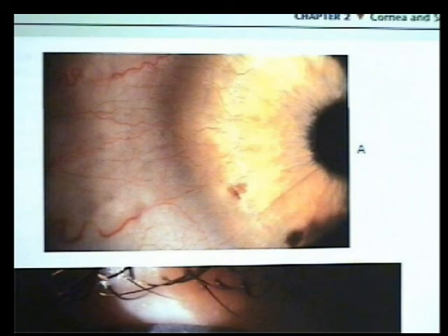Because unfortunately, with neovascularization, there's no sensation or pain connected to it, so unless they're observant, they may not see the fact that those blood vessels are growing in. Now, this takes a while. So clearly, this would be someone that did not return for follow-up visits, which unfortunately does happen. And here's a really severe case. You can see how far those blood vessels have penetrated.